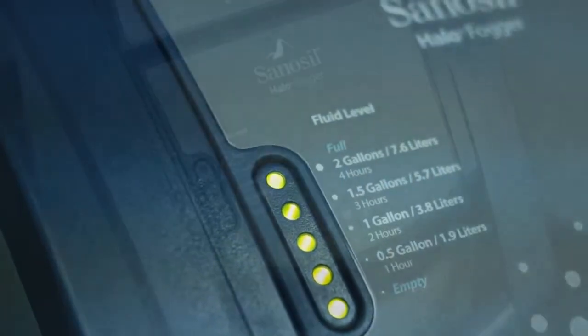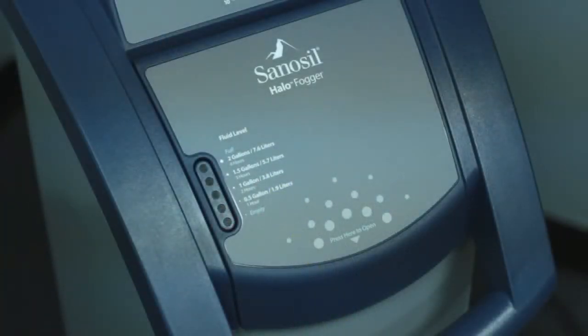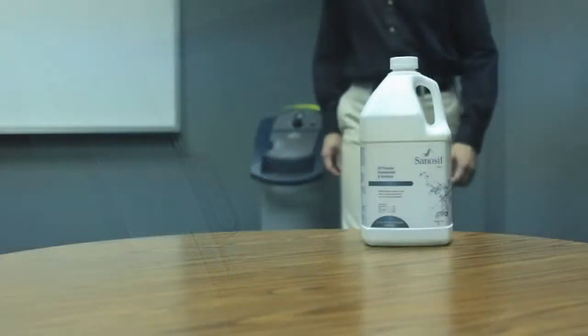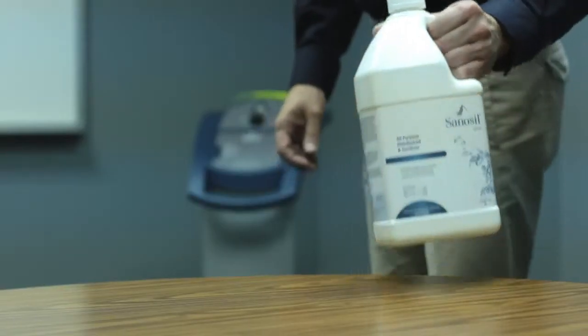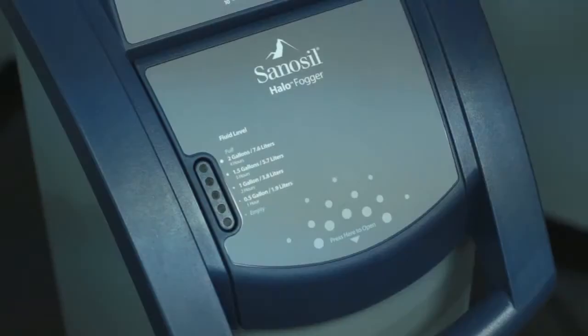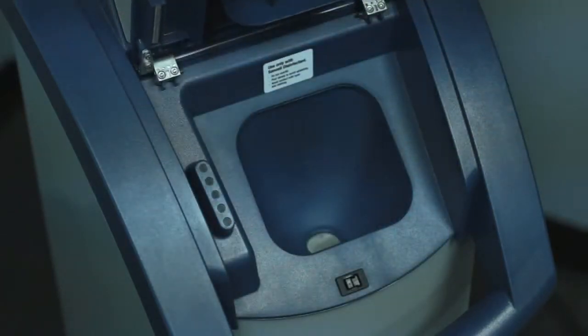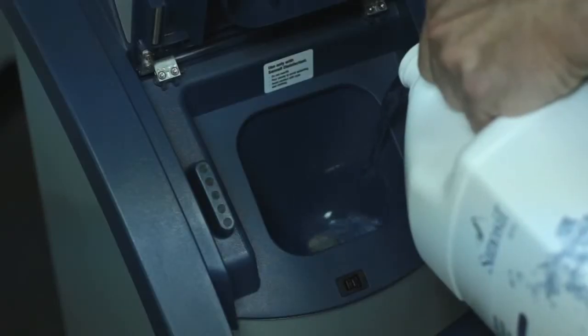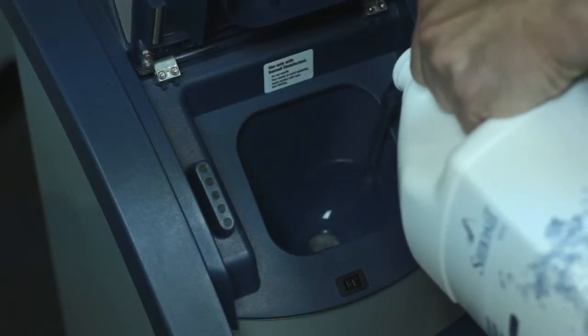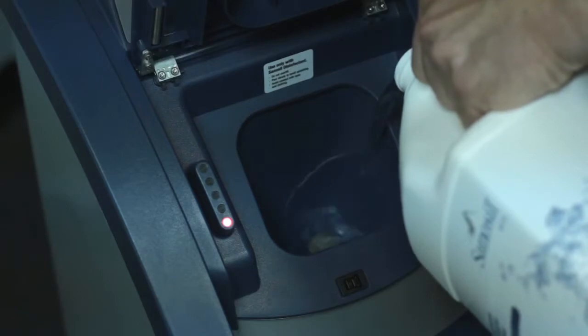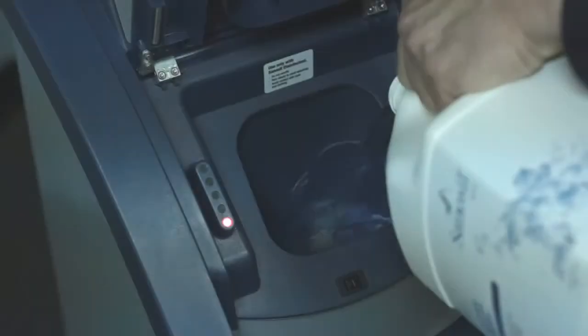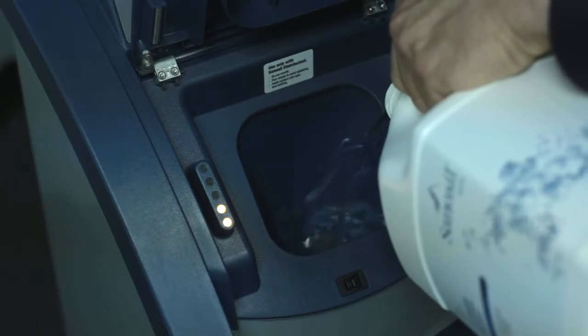The easy to read fluid level indicator will show one red flashing light if the reservoir is empty. Use only Sanosil disinfectant in the Halo unit. Do not dilute. To add fluid, press down on the reservoir door. Then lift to expose the filling funnel. Open a gallon of Sanosil disinfectant and slowly pour the contents into the funnel to avoid splashing. The fluid level indicator lights will illuminate to show how much disinfectant is in the unit.